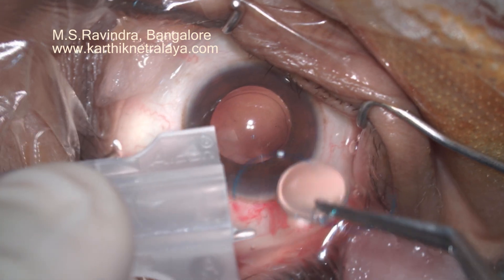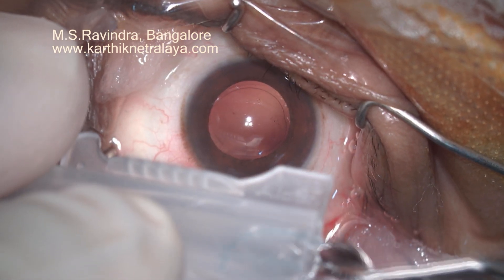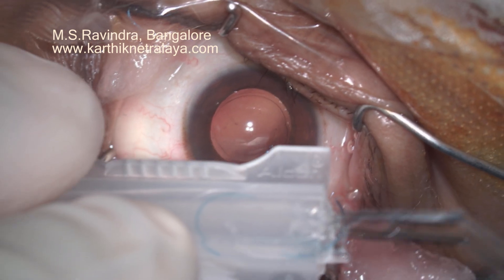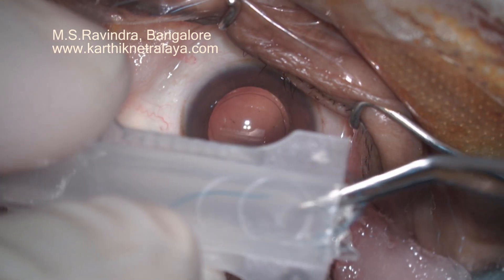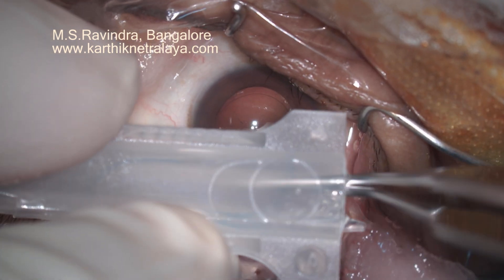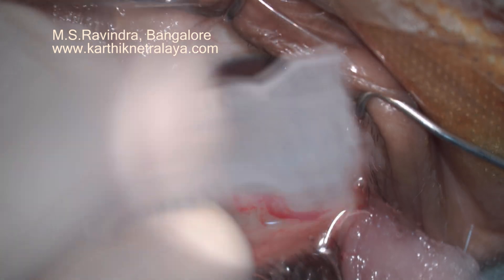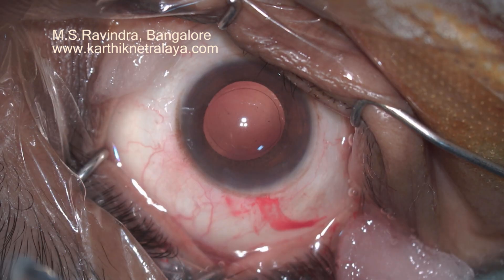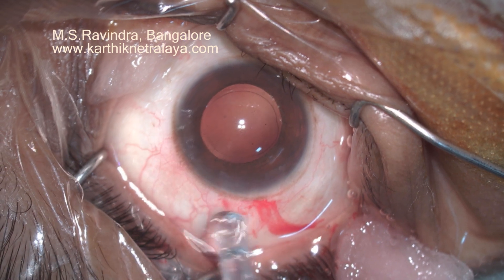A translimbal phacosuction elegantly done with good CCC. A three-piece lens is being injected into the eye without traumatizing it in any way. It is slid on the standard cartridge which is used to inject a single-piece hydrophobic lens.